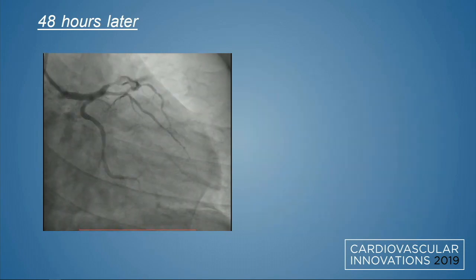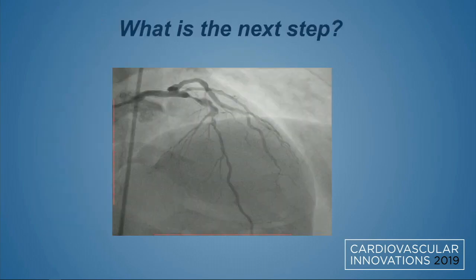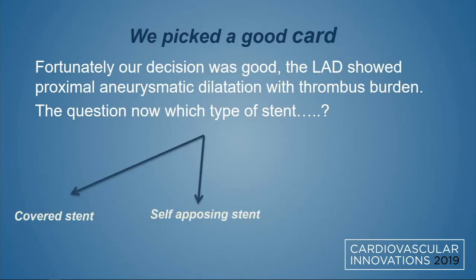So what do you think? It is an aneurysm? Aneurysmal dilatation. No, initially it looked like a contained rupture and large dissection. That was my initial impression when I saw it. So go back one more. This was the dilemma when we passed the wire.